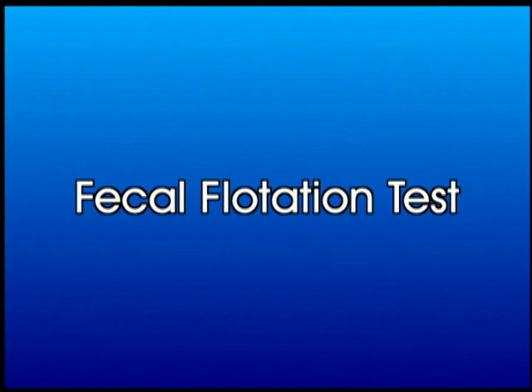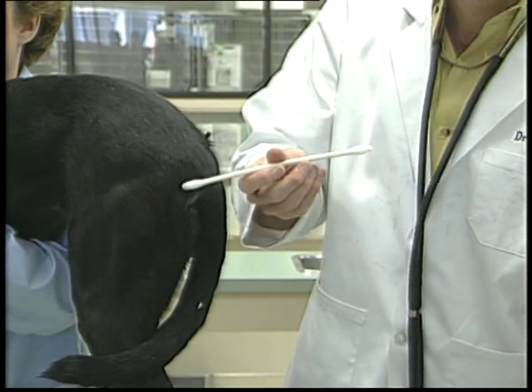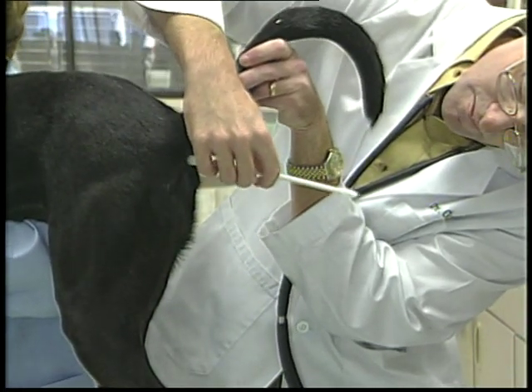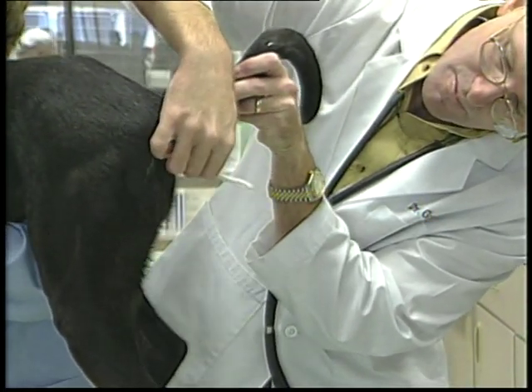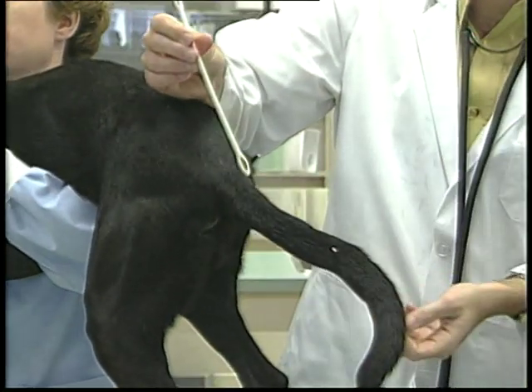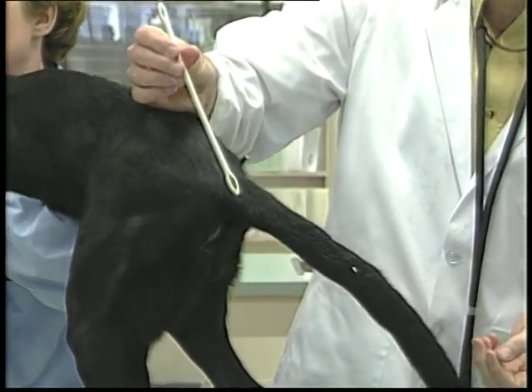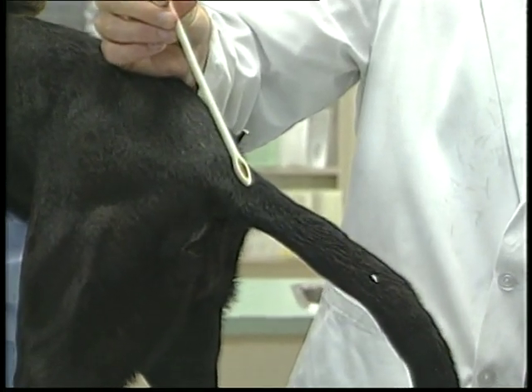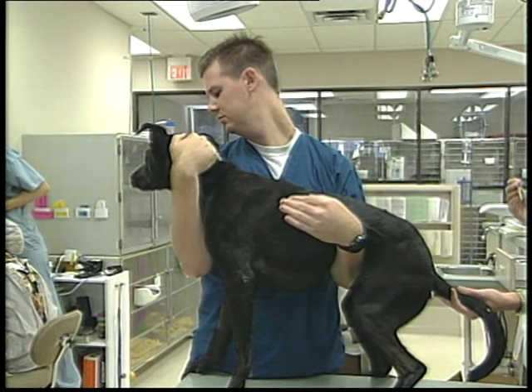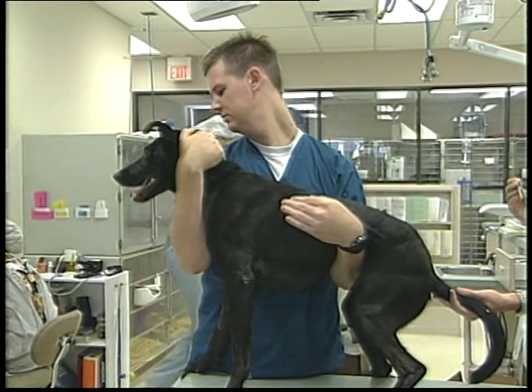If the pet owner did not bring a stool sample with their pet, you can collect one from the pet's cage or directly from the pet with the aid of a fecal loop. This loop should be lubricated and passed 1 to 4 inches into the anus, being careful not to be too forceful or cause the animal any pain. This procedure is often uncomfortable and will require some restraining assistance from another hospital staff member.